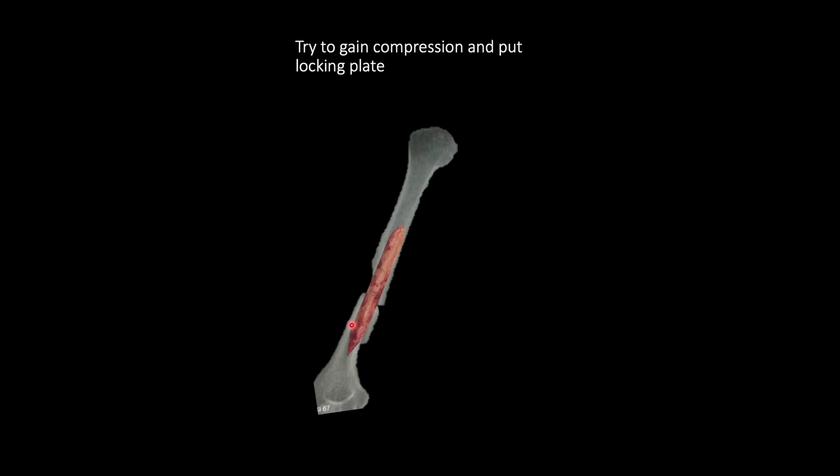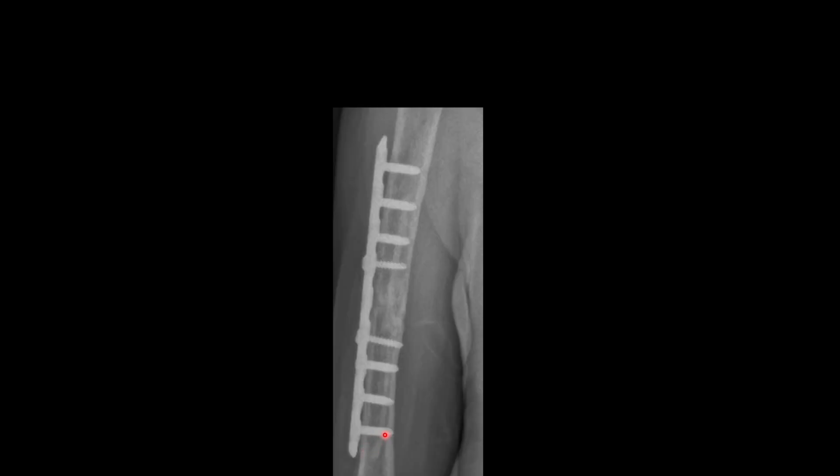When drilling, you will be drilling through four cortices: first the humerus cortex, then the fibular cortex, then again the fibular cortex on the other side, and then the humerus cortex again — so a total of four cortices. This is shown on a radiograph of a similar case in which the fibular strut was placed proximally and distally. You can see all four cortices: humerus cortex, then the small fibular cortex, then the fibular cortex on the other side, then the humerus cortex.